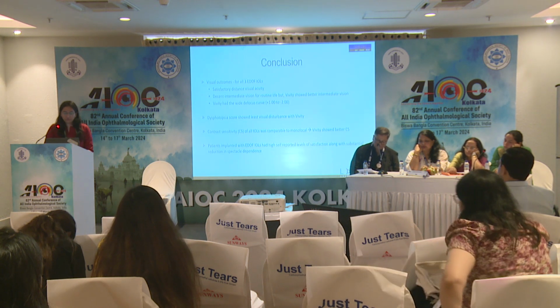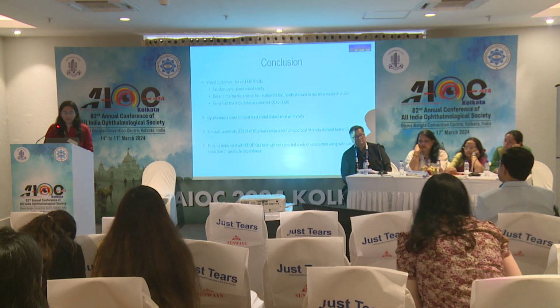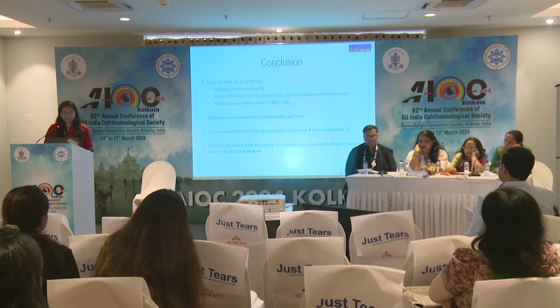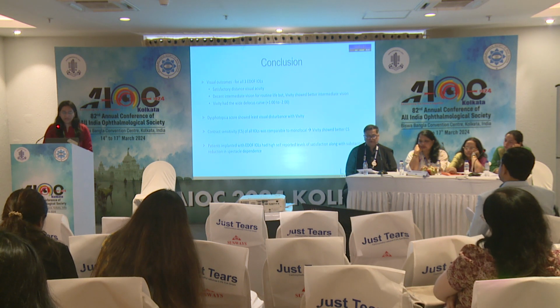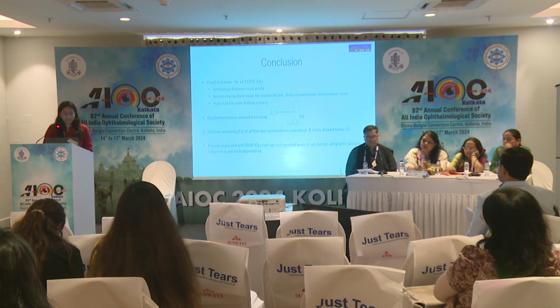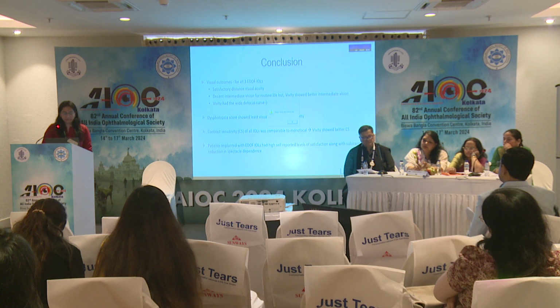So to conclude, visual outcomes for all three EDOF IOLs give satisfactory distance visual acuity, decent intermediate vision for routine life, and out of the three, Vivity showed better intermediate vision with a wide defocus curve and had the least visual disturbances, and contrast sensitivity for all the IOLs were comparable to that of monofocal IOLs. Patients implanted with EDOF IOL had high self-reported levels of satisfaction along with substantial reduction in spectacle dependence. Thank you.